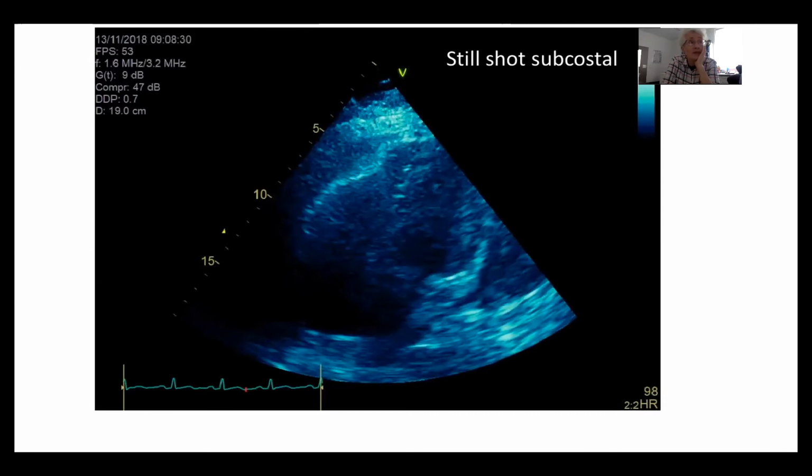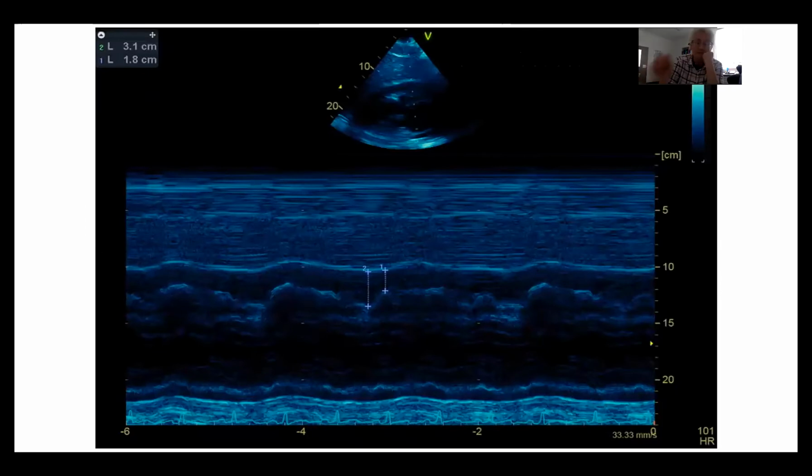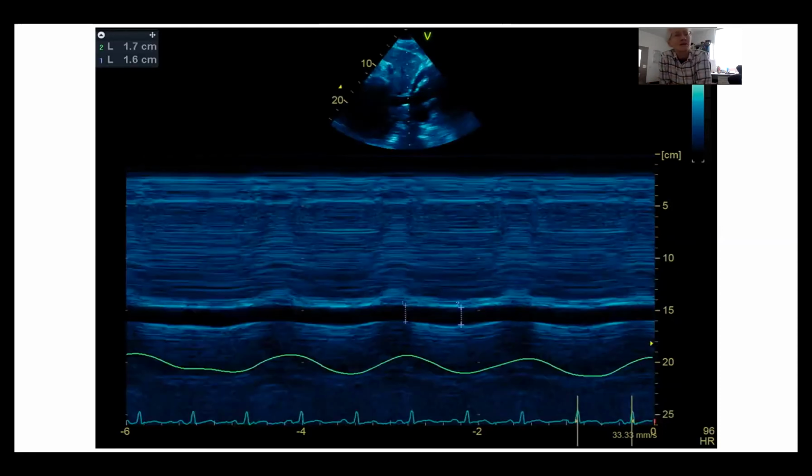Because we've certainly demonstrated ventricular interdependence, and we've demonstrated a reversal of the usual TDI results between the medial and the lateral mitral valve. Sorry, Louise, I missed the view, but are there any IVC pictures? Just for you. Is that the IVC? No, it isn't. There's the IVC. No, it's not. Sorry. I don't know why that one ended up there.